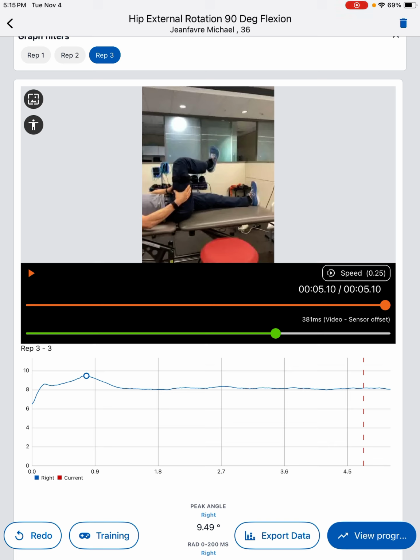As such, I'm curious about being able to work hip internal and external rotation at 90 degrees of flexion into my sequence and workflow. And I'm struggling to do so, obviously.